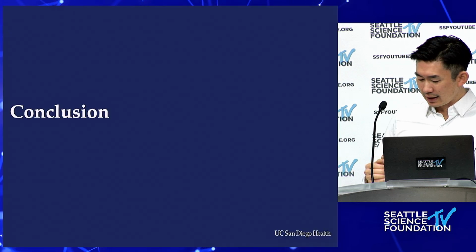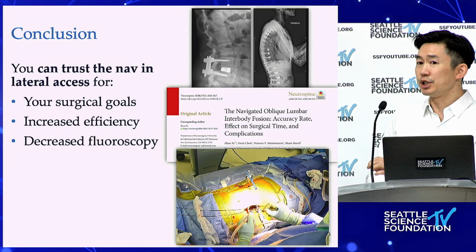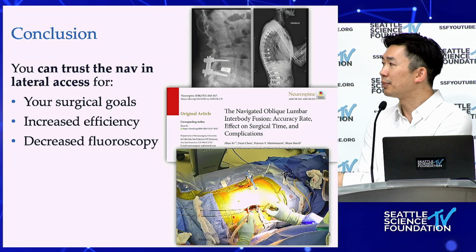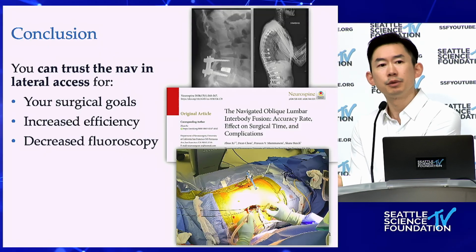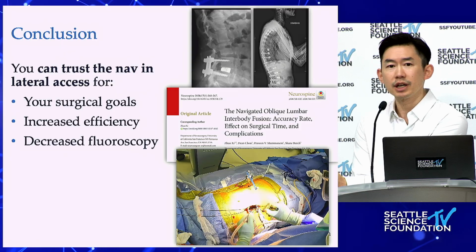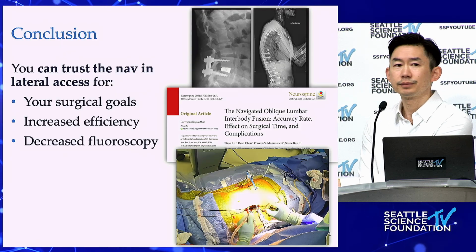But again, the idea behind the nav is that it may not be super perfect, but you have all the other benefits. It's faster, and as Bill would tell me at UCSD, X-rays are not free. You're going to accumulate them over time, so the more lateral surgery you do, if you can offset some of that to make you safer as a surgeon and healthier, I think it is certainly worth it.